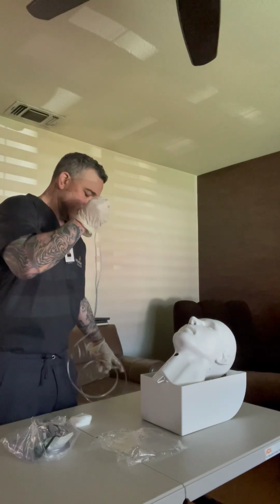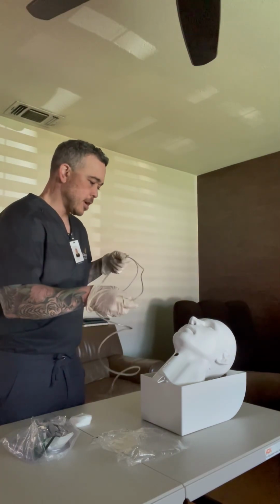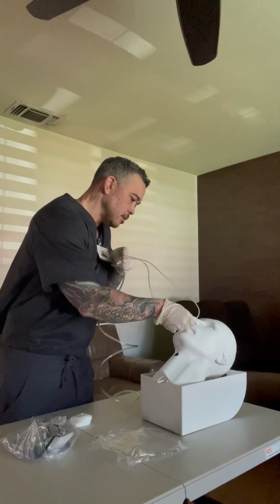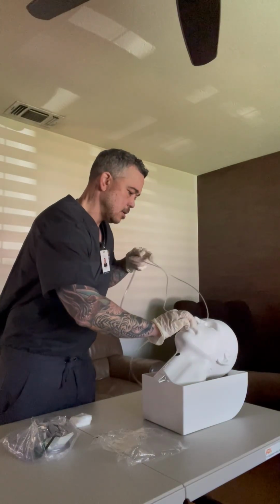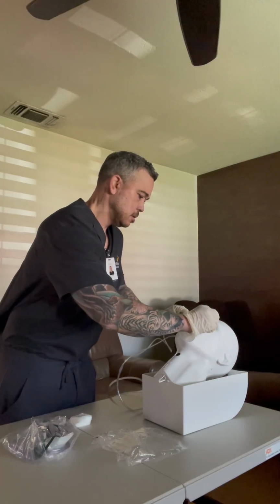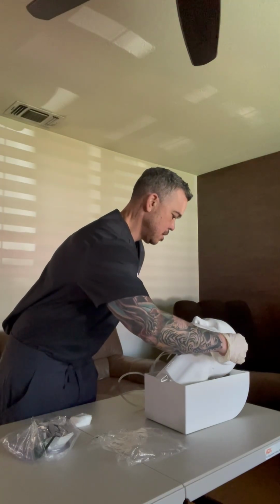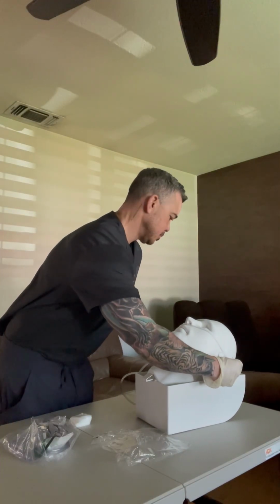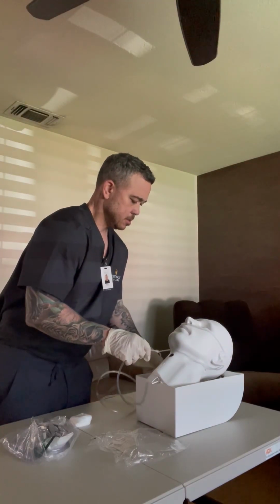Okay. All right, Mr. Smith. So now the next thing we're gonna do is these little tubes right here are gonna go into your nose. You put this in your nose, and it's gonna go down here, like so. Okay. Going there like this. Okay. Then I'm gonna take this side and take the rest of the tube and put it around your ears on both sides like this. Okay. All right. Put it on there.